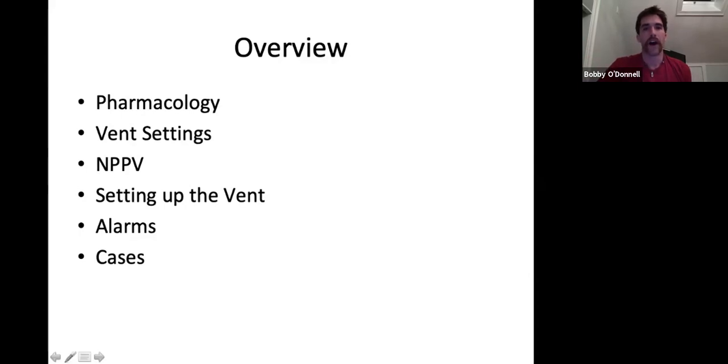So we're going to do the overview of the night. I'll try to keep it short but efficient. When it comes to training, I don't like having my time wasted, so I try not to waste other people's time. I want you to be able to take something out of this. A lot of it might be review for you, but this might be new to some people as well.